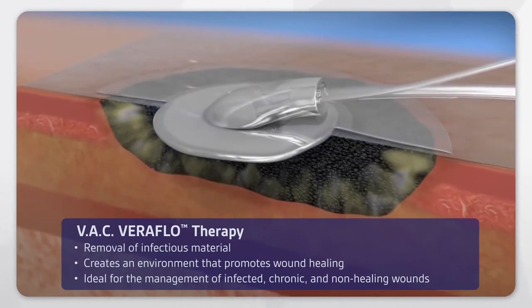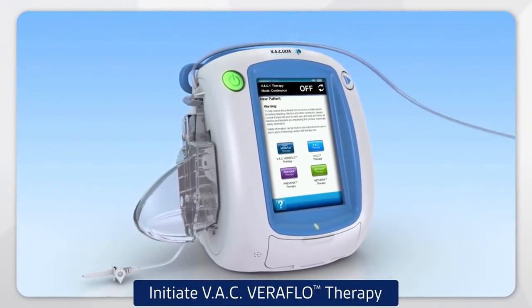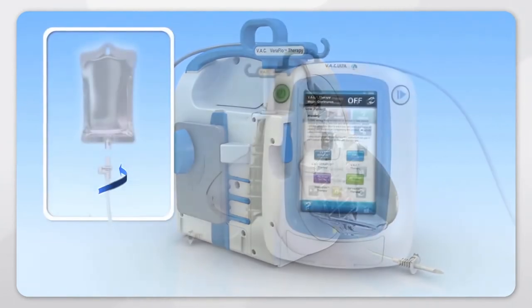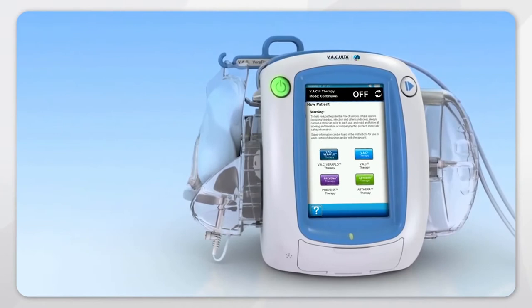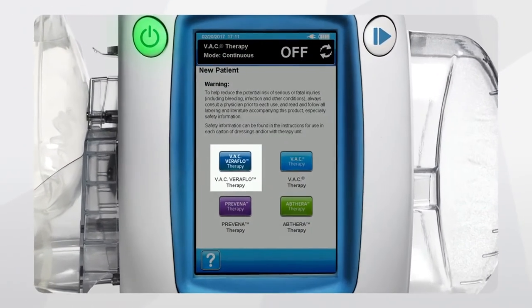This is ideal for the management of infected, chronic, and non-healing wounds along with appropriate good clinical practice such as debridement and antibiotic therapy. To initiate VAC VeraFlo Therapy, attach the VAC VeraLink cassette for convenient solution storage and delivery. Raise the solution container hanger arm, rotate it 180 degrees and lock into place. Spike the solution container, rotate the spike a quarter turn and position it in the VAC VeraLink cassette. Attach the VAC Ulta canister 500ml or 1000ml to the VAC Ulta 4 Therapy Unit. Press the dark blue VAC VeraFlo Therapy button.